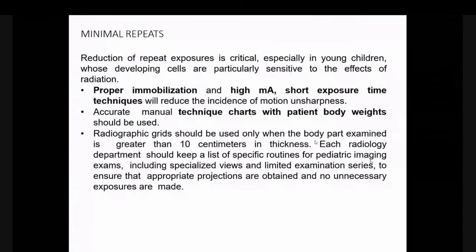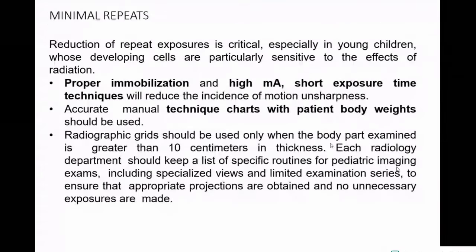So handling the pediatric patient is also a challenge, but doing the radiograph is again the biggest challenge in radiography. So the reduction in repeat exposure is the most important. If we have multiple radiographers, more than 4 or 5, we need to find out which radiographer is best for pediatric radiography, so that we can mark this radiographer for pediatric radiography and he can teach the other radiographers how to get a better image, so that the new or other radiographers can learn and get experience from the experienced radiographer.